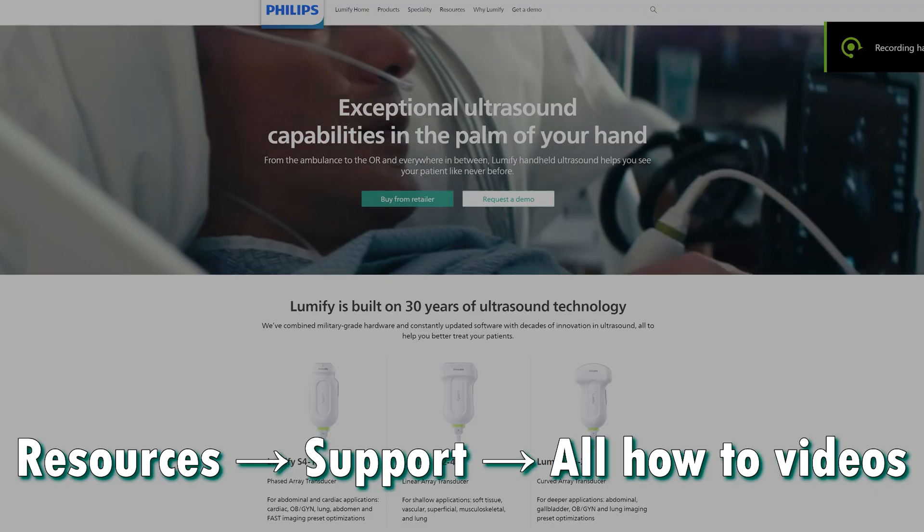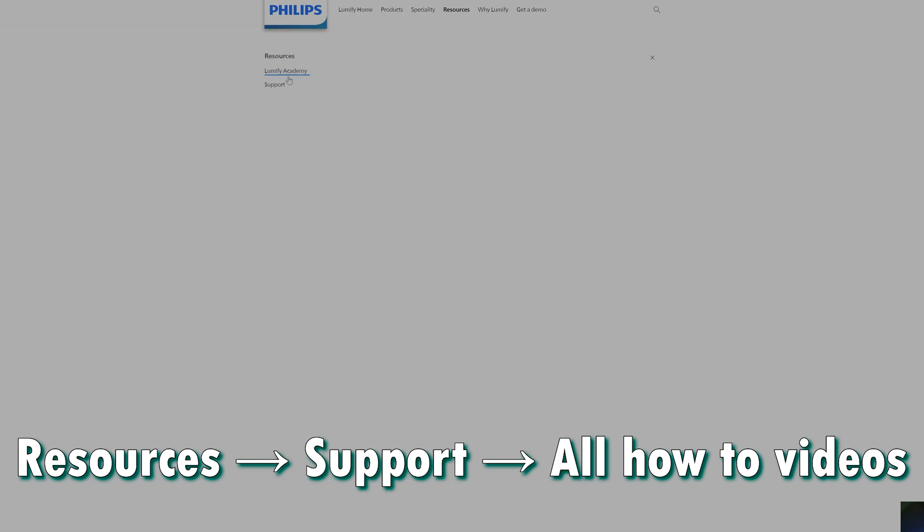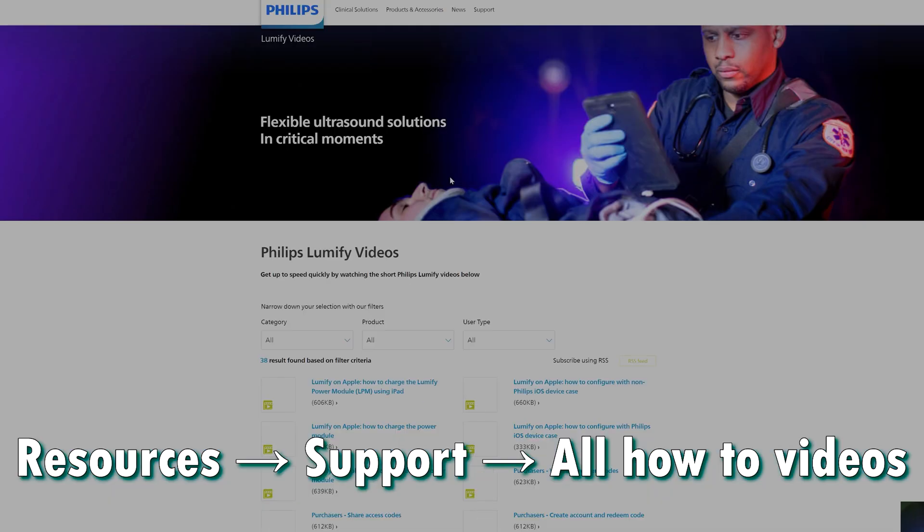There are many more settings to play with, but honestly the Philips website has pretty good video tutorials — they're just in a really hard to find location.